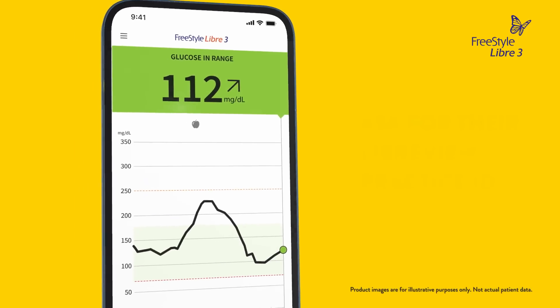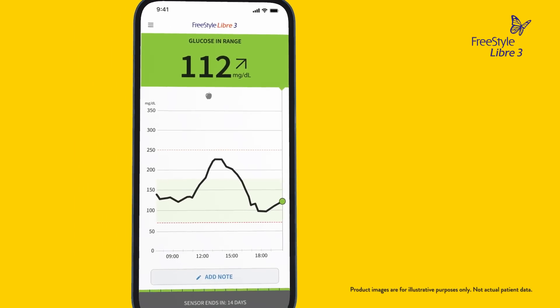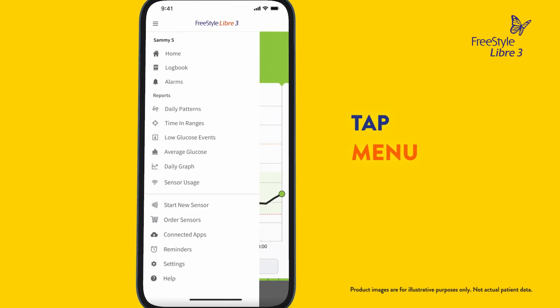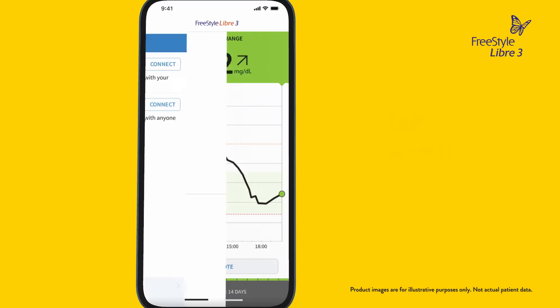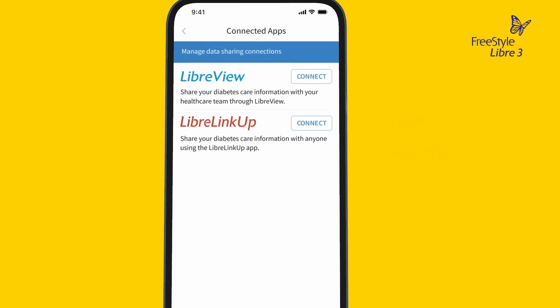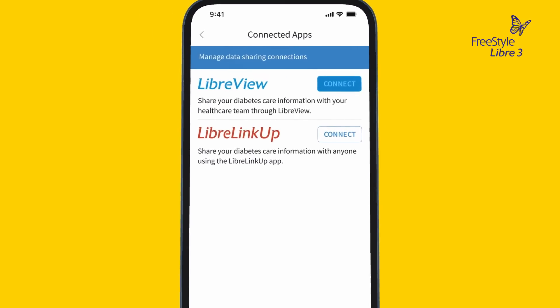To connect with your doctor, go to the Freestyle Libre 3 app home screen and tap Menu. Then tap Connected Apps. Then tap LibreView and connect or manage.